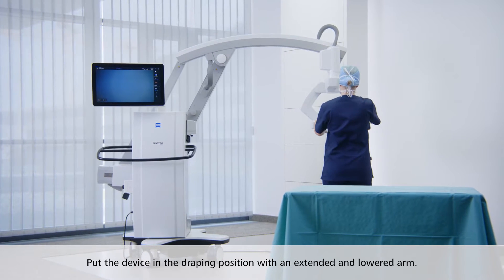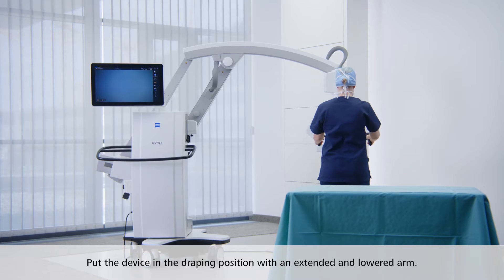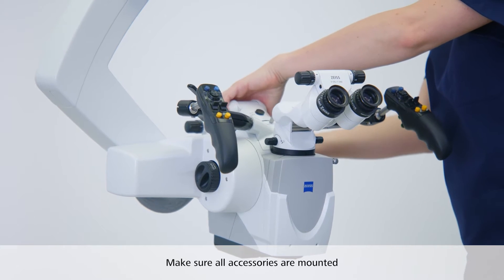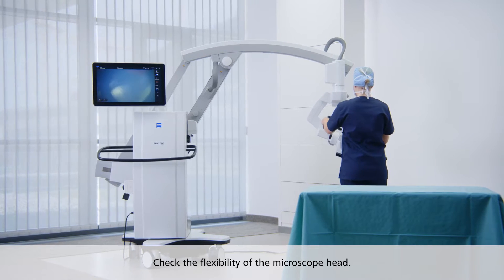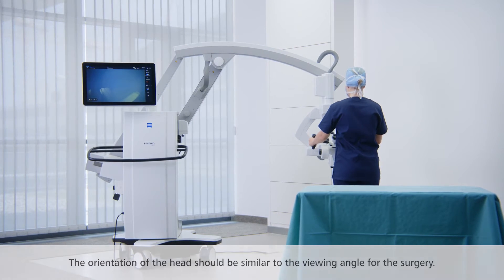Put the device in an appropriate draping position with an extended and lowered arm. Before draping, make sure all accessories needed for the surgery are mounted on the microscope head and the system is balanced. Please check the flexibility of the microscope head. The orientation of the head should be similar to the viewing angle for the surgery.